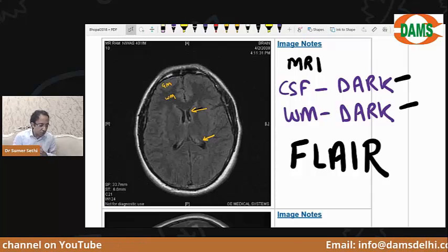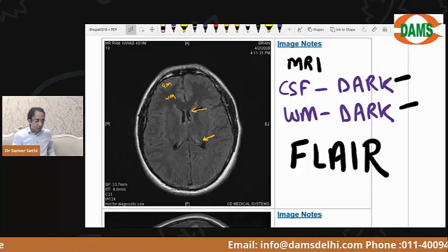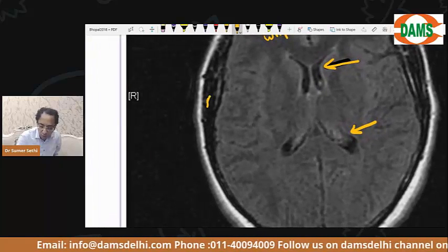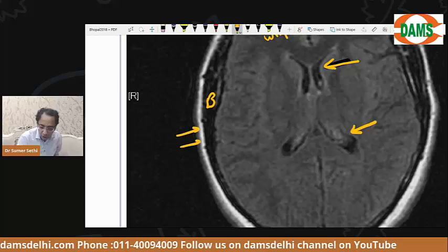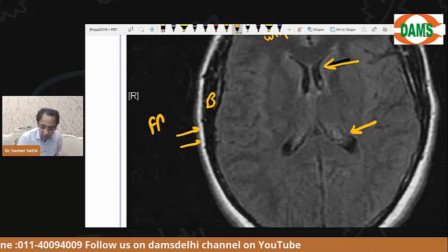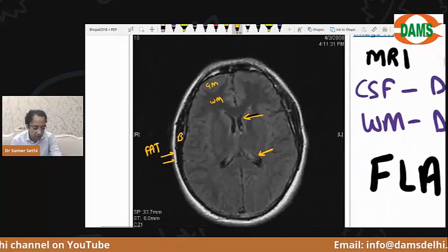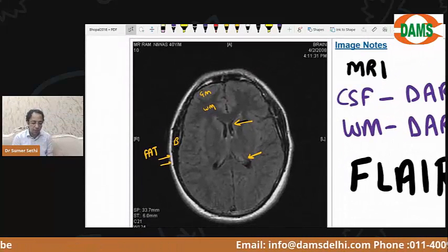Everybody? Okay, I can see most of you are able to answer this. Okay, bone white नहीं है ना बेटा, देख bone ये वाली है बेटा, you're getting confused. Bone ये वाली है बेटा, ये bone नहीं है, ये fat है, ये हमारी scalp में fat है बेटा जो white दिख रहा है, क्योंकि fat is white on MRI and most people do it wrong in the real exam.